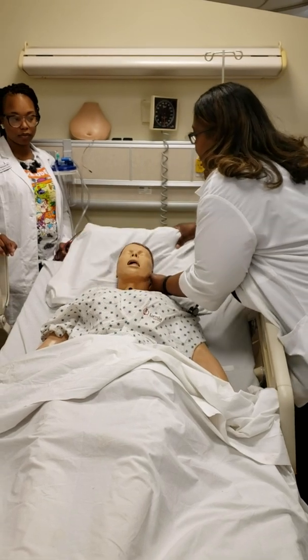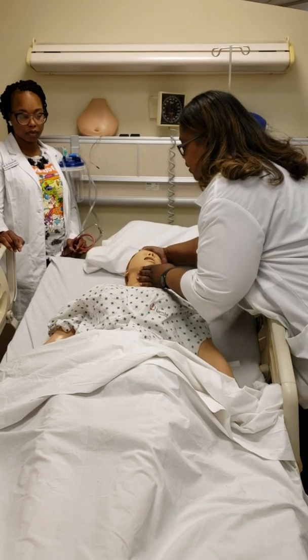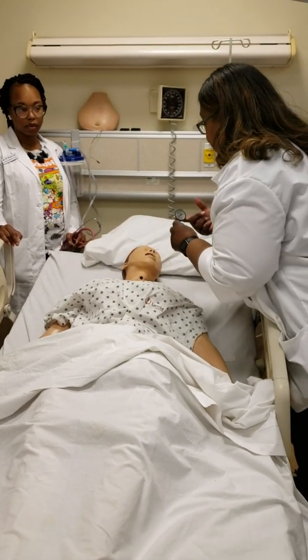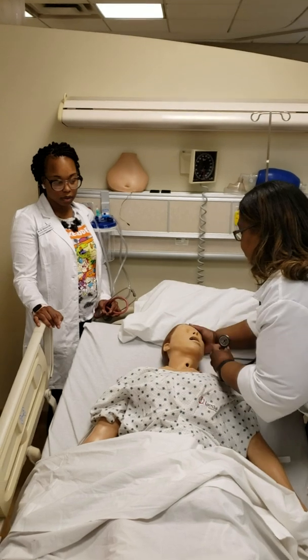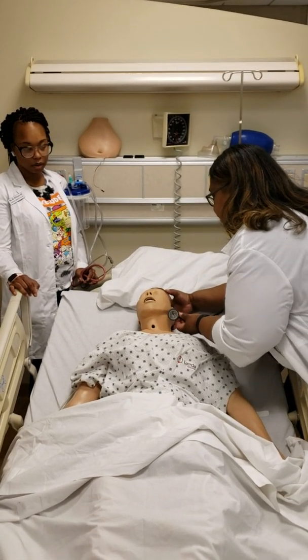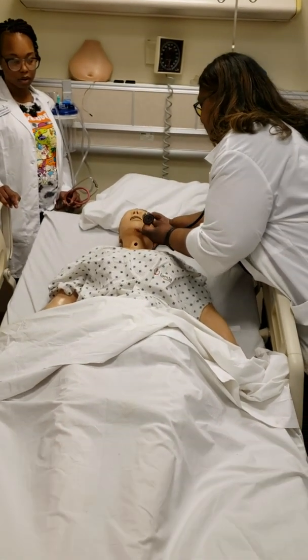I'm going to take the pillow from underneath his head, and then I am going to have him turn his head one way. And then with the stethoscope, with the bell, I'm going to say, can you hold your breath? I'm going to assess the 3 spots. Okay, you can breathe. I'm going to turn your head the other way. I want you to hold your breath again. Assessing 3 spots. Okay?